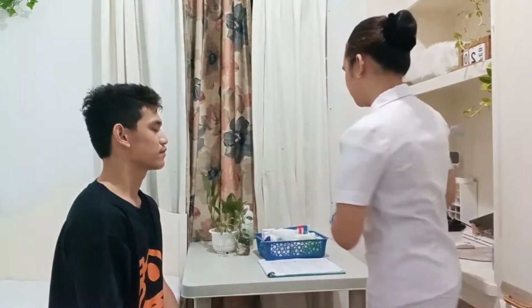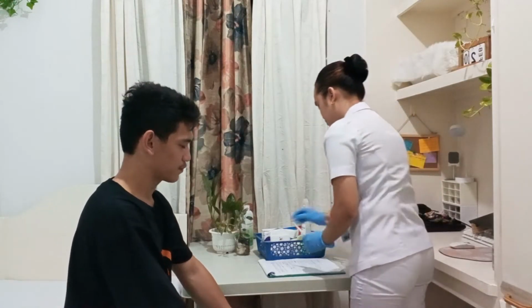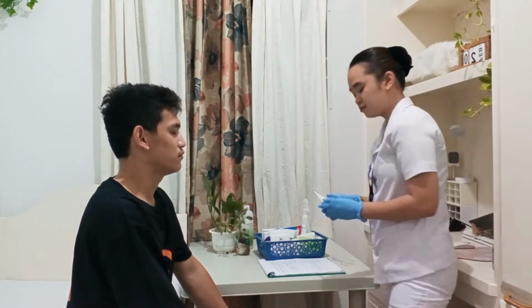Now I'm going to perform first the oral method of obtaining body temperature. But first, I'm going to position my client appropriately. Okay, so my client now is in sitting position, and I'm going to disinfect my thermometer using an alcohol pad in a firm twisting motion prior to the placement. After disinfecting, I will now place the tip of the thermometer on either side of the frenulum.